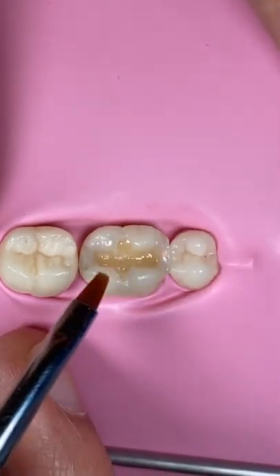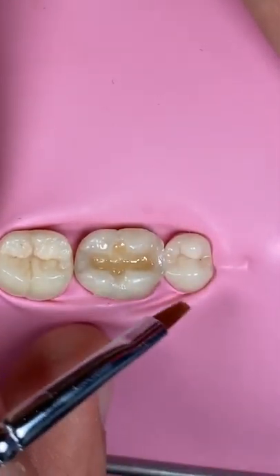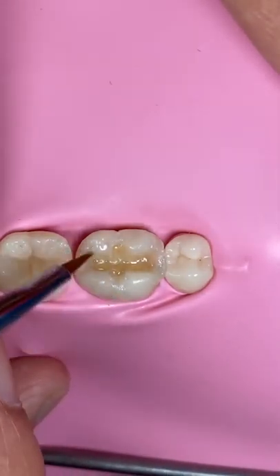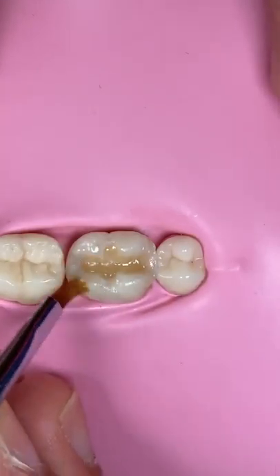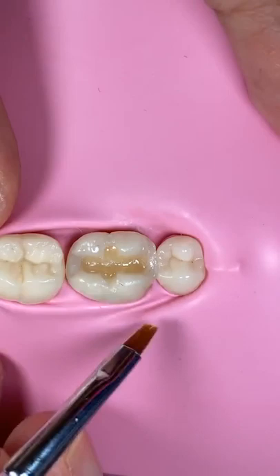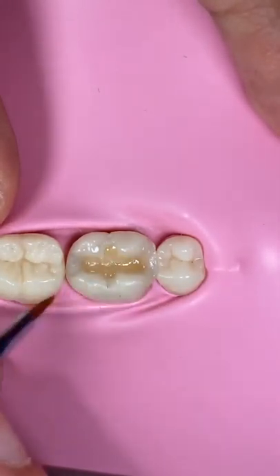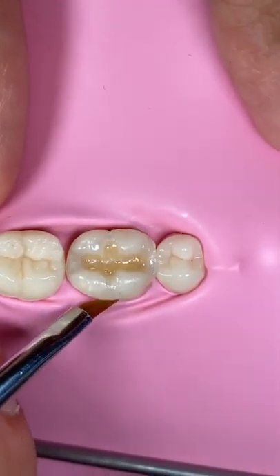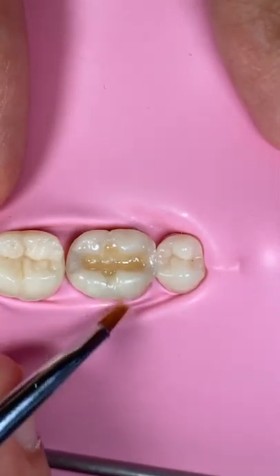This is the labial, right? So make it like you are doing the anterior. So instead of using a yellowish dentin like for the occlusal filling, you use the recipe for the anterior. Don't use the same recipe as the occlusal filling. Yeah, just make it flat like this first.